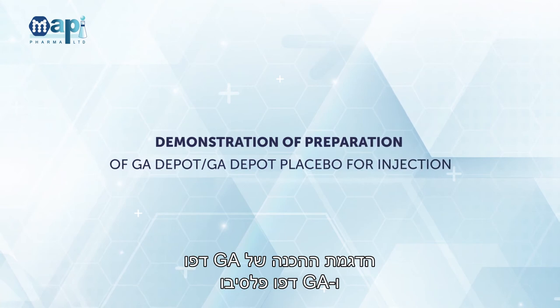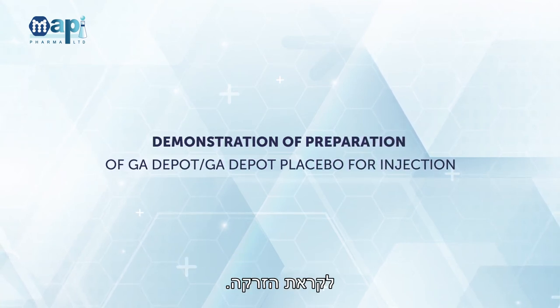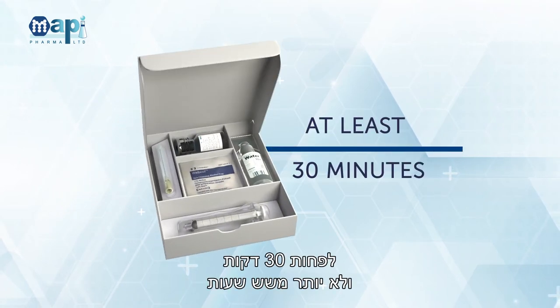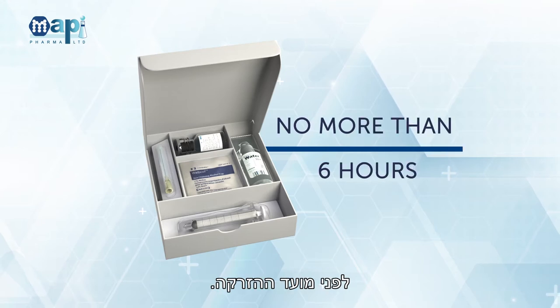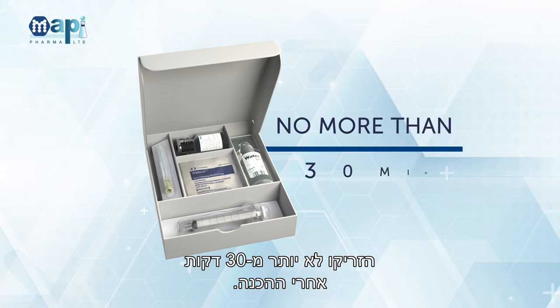Demonstration of Preparation of GA Depot and GA Depot Placebo for Injection. Take the injection kit out from refrigeration at least 30 minutes and no more than 6 hours before the dosing time. Inject no more than 30 minutes after preparation.